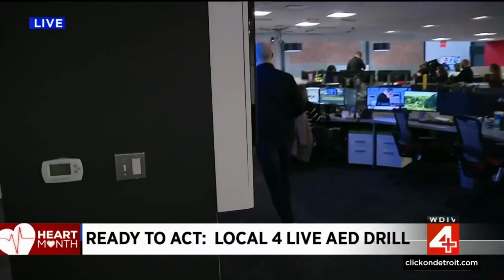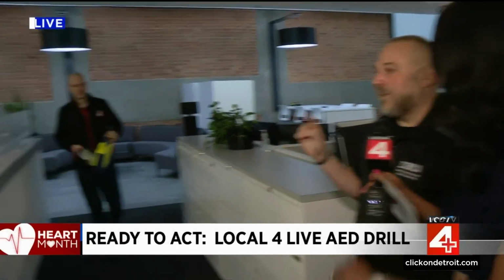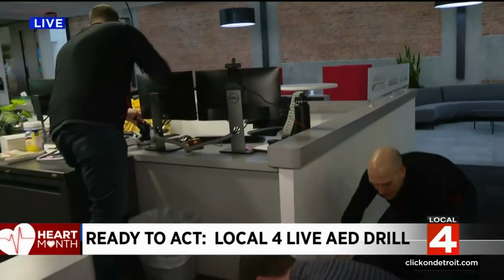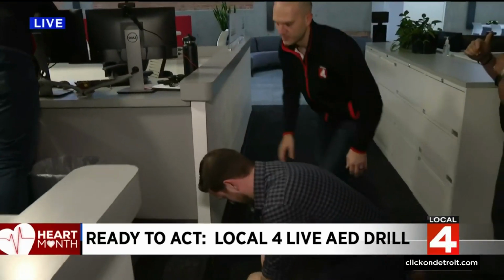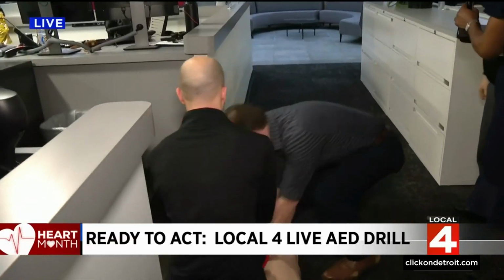You're definitely doing the right thing right now. We got someone calling 911, which is the most important thing. Hopefully he'll put it on speakerphone. We got someone doing CPR, and we got the AED coming. I need someone to rotate the CPR. The only other thing that should be going on right now is someone should be at the door waiting for EMS to arrive. Okay, so now we have them doing the compressions.